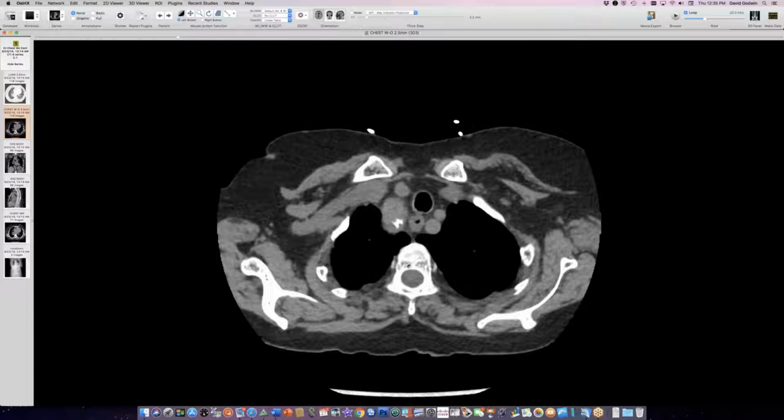Yeah, that's old literature, surgical literature based on cases going to surgery. And of course, the double arch is going to be more common because it's much more symptomatic. But now that we do CT imaging on everybody, I think I've seen 3 or 4 double aortic arches in 10 years, including all the congenital heart disease stuff I do. And we see right arches all the time that are asymptomatic. So I think that old literature is just wrong.